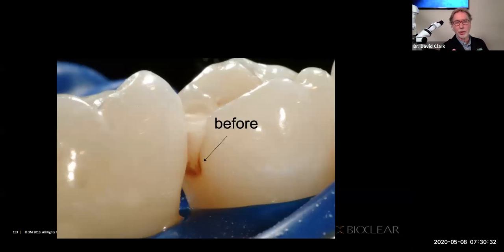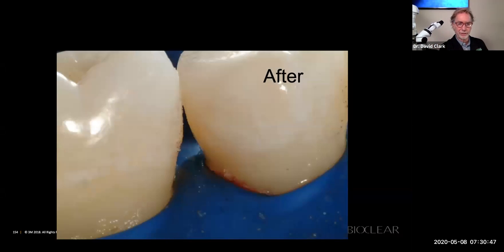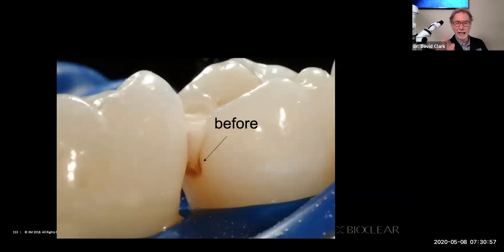Let's see here. Oh, here's the point. This is the GV Black prep that we were all trained to cut. And this is the prep you cut at Minnesota most of the time and at a lot of the other schools. That margin is going to leak no matter what you do. I'm sorry, when you do the Bioclear method and you do injection overmolding with additive dentistry, that insane restorative seal with low C factor allows you to keep caries in the tooth. So let me back up the point. Let me have all the faculty talk about this right now. If this is the kind of margin that we create, is selective caries retention going to work long term? If this is the best I can do, and this is standard of care, that is standard of care in a Class 2 right now in a box prep. If that's the best I can do, is selective caries retention going to work?